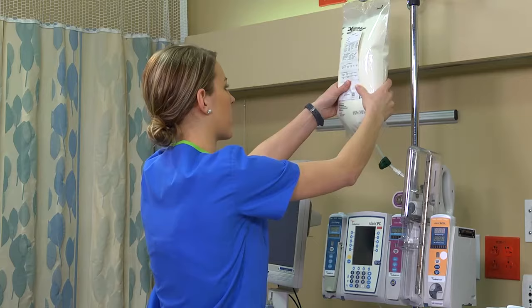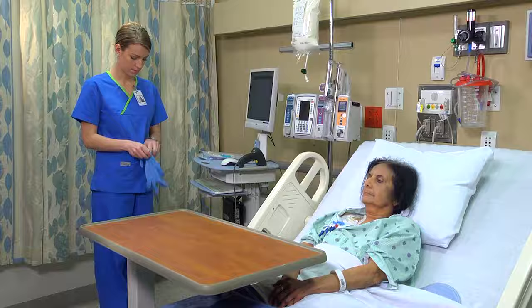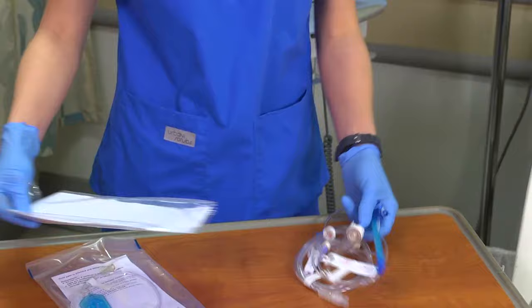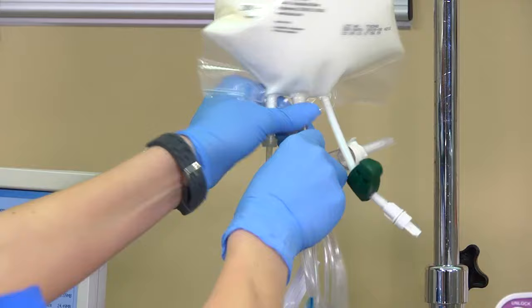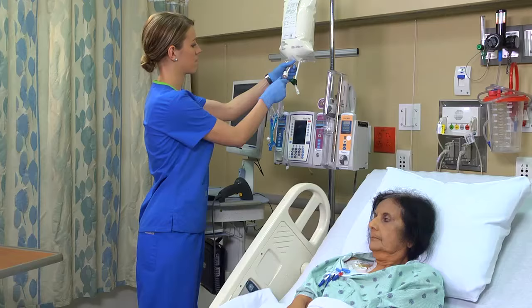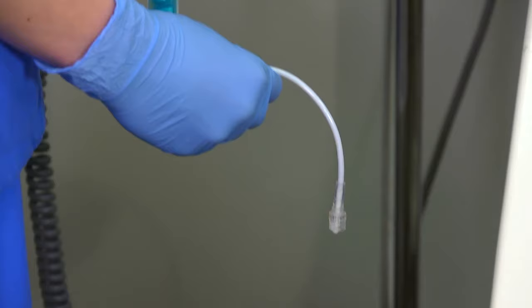Now perform hand hygiene. Apply clean gloves. And attach the appropriate filter to the IV tubing. Prime the tubing with the CPN solution, making sure that no air bubbles remain.